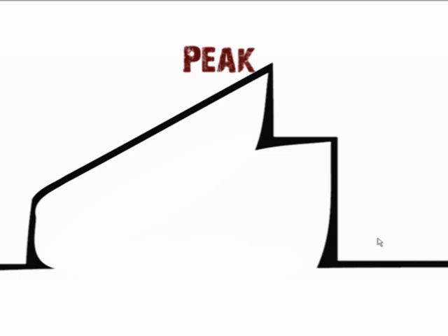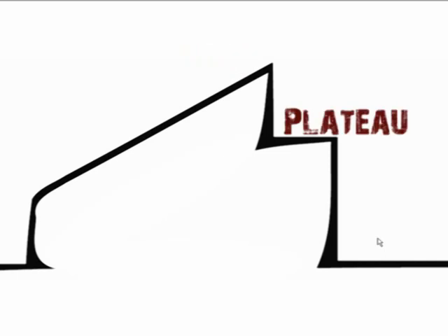Now you can see, after you get to that top portion of the waveform, it kind of levels off for a second before it drops back down. That's your plateau pressure. That's once the system is equilibrated with your alveoli, that's the pressure they're actually seeing. That's the number that matters. If that number is good, the alveoli are safe, and if it's not, they're at risk of barotrauma.